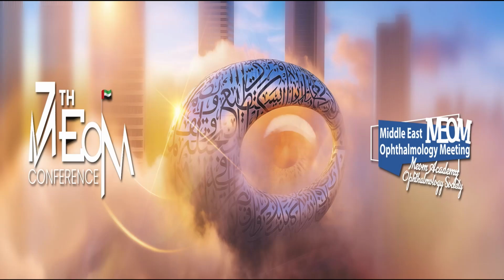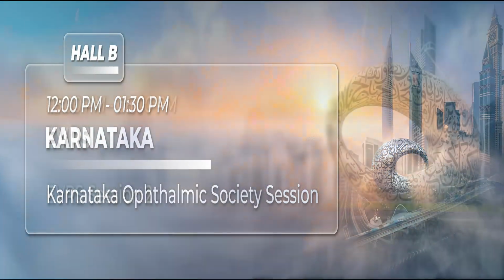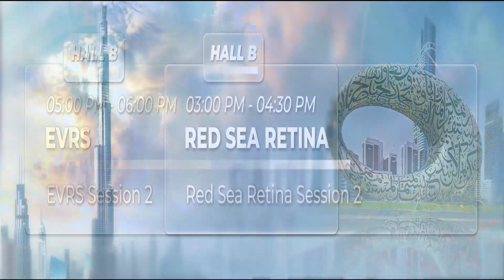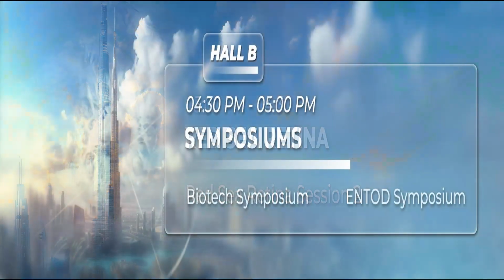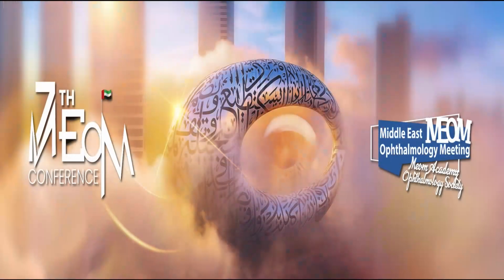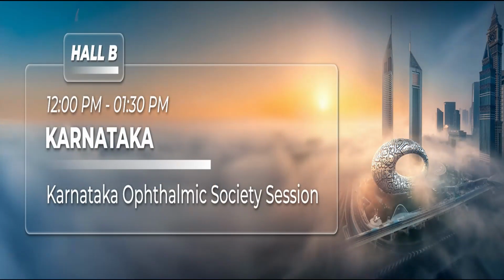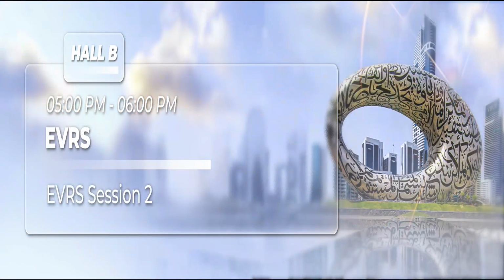It's useful and without any slippage. In my experience, over 20 years, I usually use PFCL exchange with air, and after this, I have a choice to use gas or silicone independent of the localization of the GRT. Why? Because the secret is very simple.